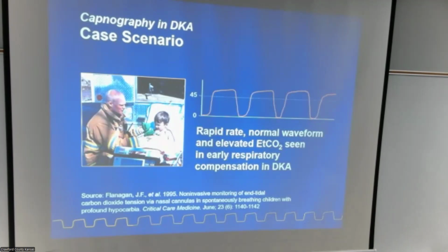Just had this yesterday. Capnography and DKA: rapid rate, normal waveform, elevated end-tidal CO2, early respiratory compensated DKA. Of course, it's, what was it, 916? East 8th Street. Once again, he's in DKA. Blood sugar was high. We pulled up on the porch. He just wouldn't stop puking, so we said, let's get him back to the truck. Same thing.